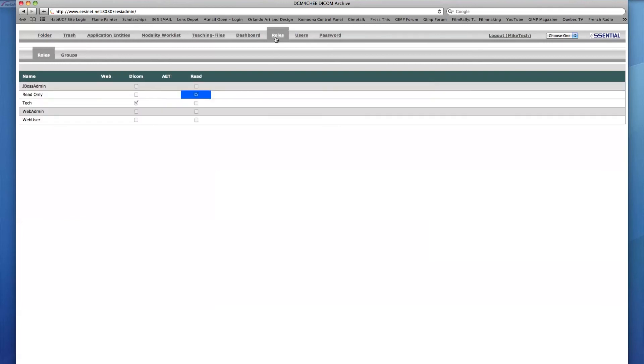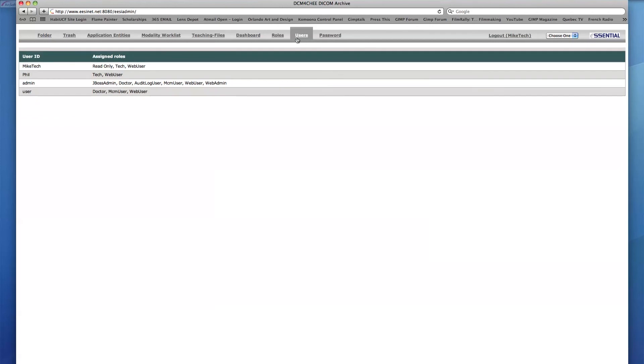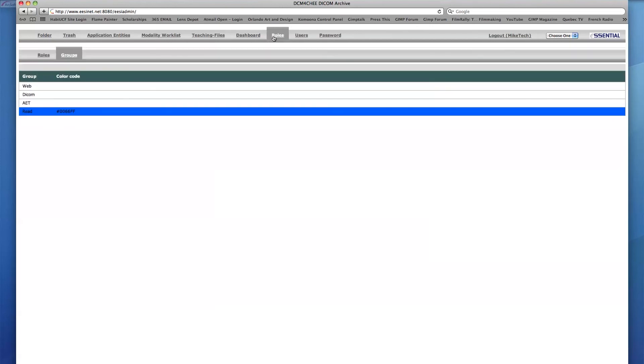Finally, under the Roles and Users tabs, there are no editing, deleting, or creating new users capabilities, but rather only viewing capabilities. Roles designated as Hidden Roles will not be visible to Mike Tech.